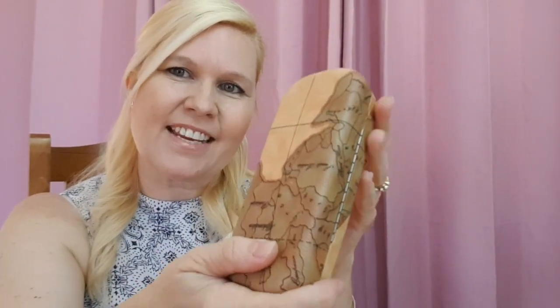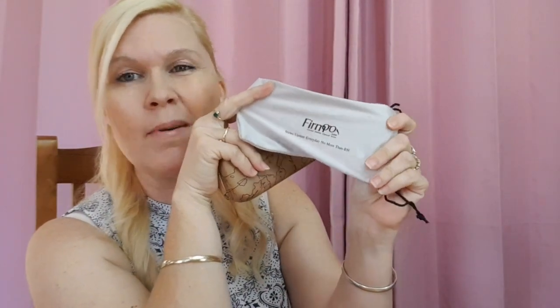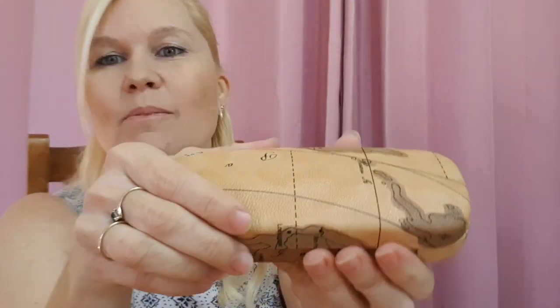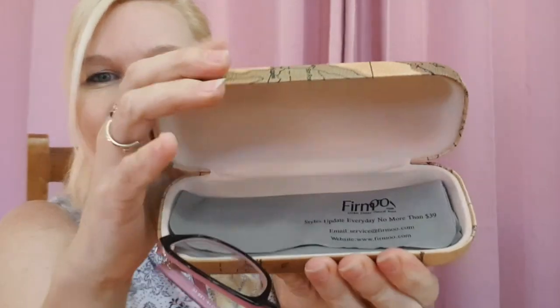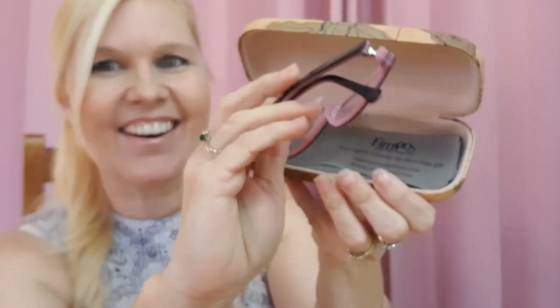It comes in a nice hard case — it looks like a map, which is a really interesting and different design. The hard case means your glasses will be protected in your handbag. It also feels like a cleaning cloth so you can put your glasses in there and then into the case. I'm just going to open them up — you're going to be first to see — oh look at that, I'm excited guys!